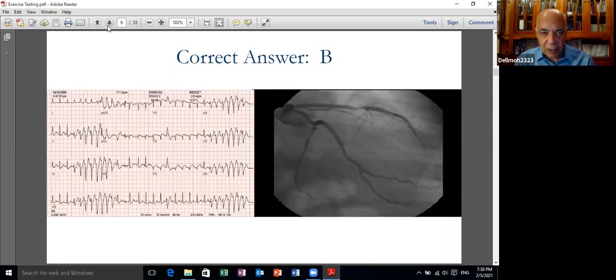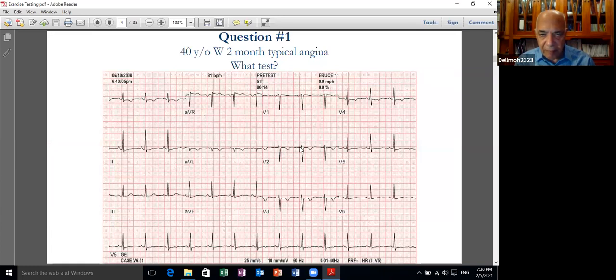So, in this patient, because the ST elevation occurred in the right precordial leads, you have a critical stenosis in the proximal LAD. Another important point, if you look to the location where the ST elevation is occurring, you will find that there is a Q wave. But if you go back to the original electrocardiogram, there is a small R wave in V2 and V3. So you cannot depend on elevation of the ST segment in patients who are carrying a Q wave in that electrode, in that area. The Q waves appeared later on, probably because of changing in the cardiac axis as a result of increased respiratory rate.